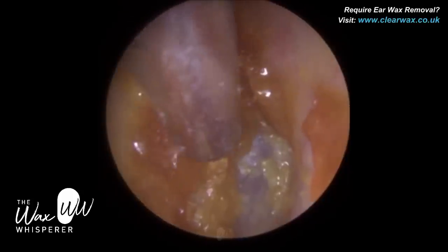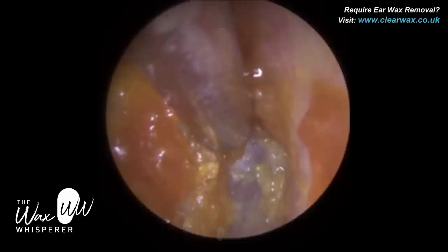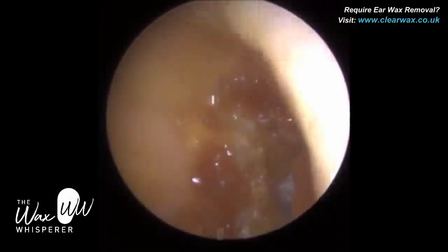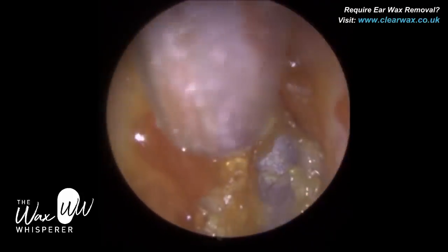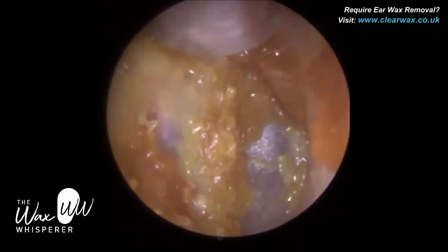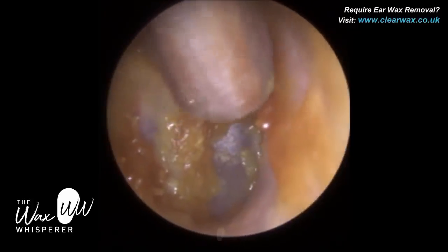With an endoscope, you feel like you're inside the ear itself and you're enclosed. The magnification of an endoscope, especially our endoscope that we've developed — the iClearScope — we've worked really hard not only to ensure it has the wide field of view, which is a hallmark of an endoscope in any case, but also the magnification. The eardrum is really close up, so we can perform these types of procedures.